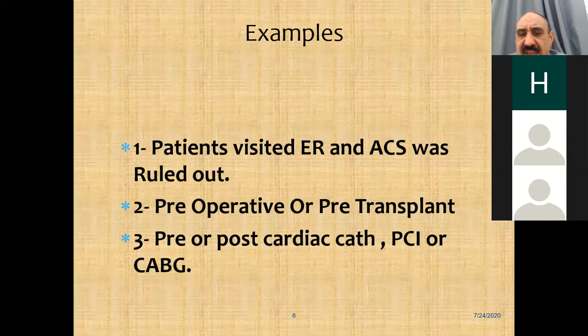It has now become standard in our center to send patients for any major operation or any transplant, liver or kidney. Sorry, kidney or liver transplant. Usually, these are the types of transplant we are doing, and these are the types of patients we do the nuclear cardiology test for. So this is the second category.